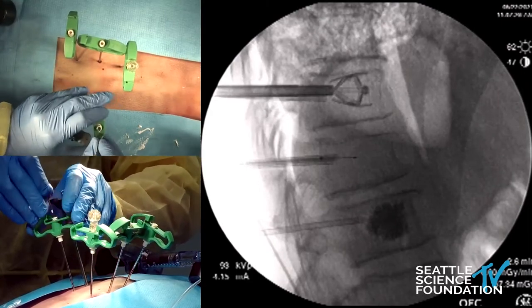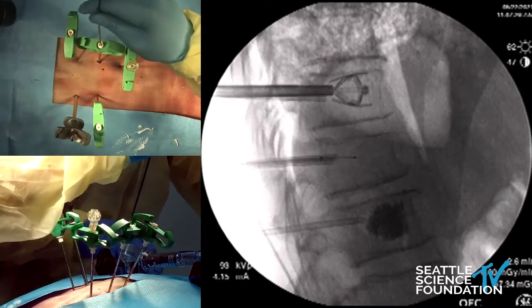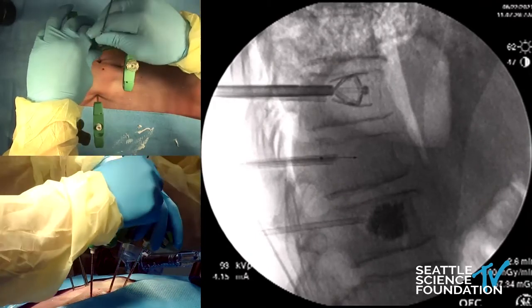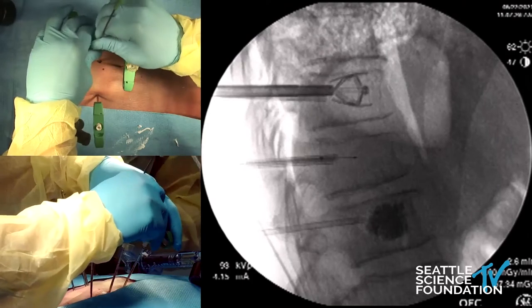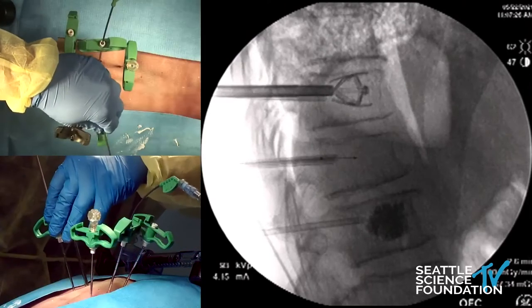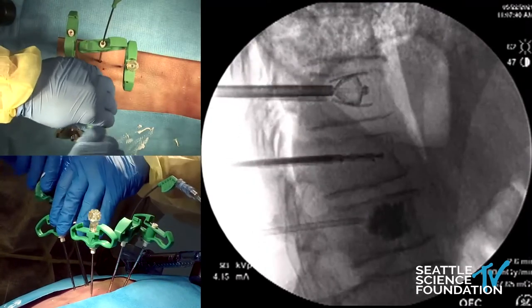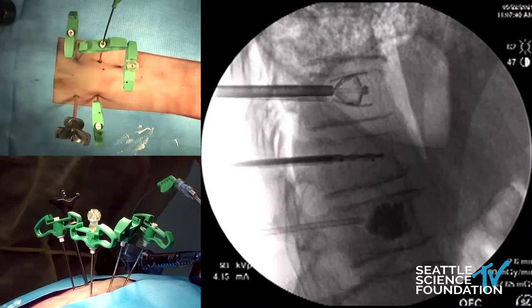I need to drill mine a little bit more, so go ahead and place yours down. That's going to show you where your balloon is, and you want to make sure that it is clear of the cannula so that when you expand the balloon, you're not going to have any of that balloon catching on it. I'm just drilling to make sure I have room for the balloon to go down.